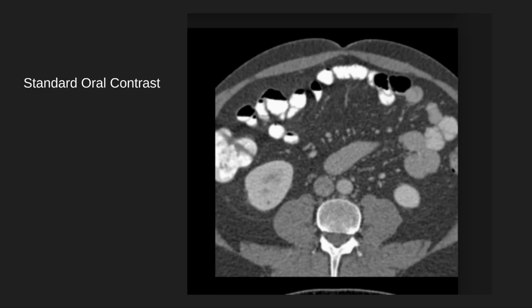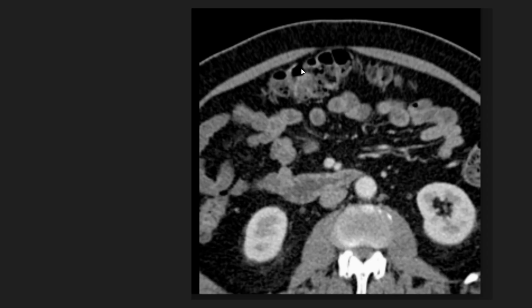And typically there's another oral contrast that's given that's way better and way more common, and that is known as the Volumen. So Volumen is an oral contrast, which is pretty much like water that goes inside the bowel and it attracts the water inside.